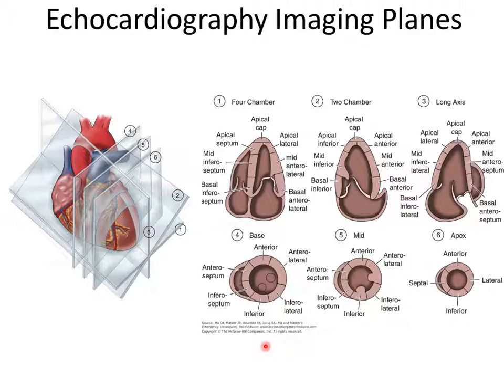You can imagine you could flip one of these such that the anterior wall of the heart was down here, i.e. the patient was upside down, and her chest was down here. It would look relatively similar because it has symmetry along this axis. And now you flip the heart over and you're getting the wrong call, because you're naming the anterior wall the posterior wall, right? So you got to keep this clear. Right?